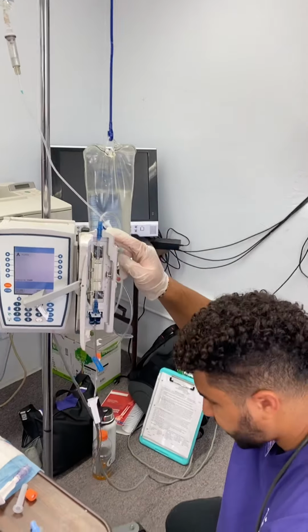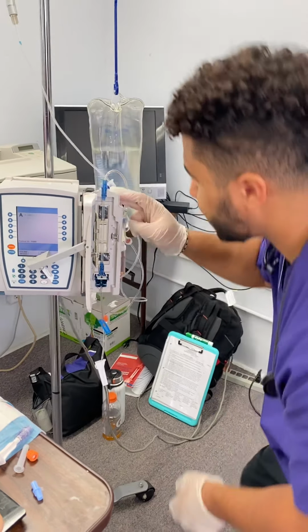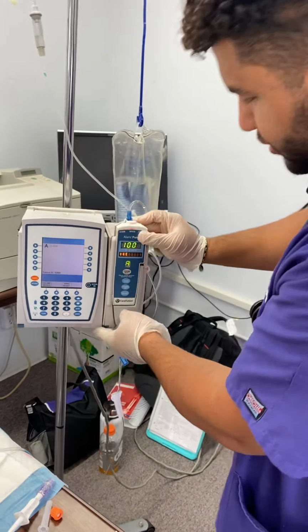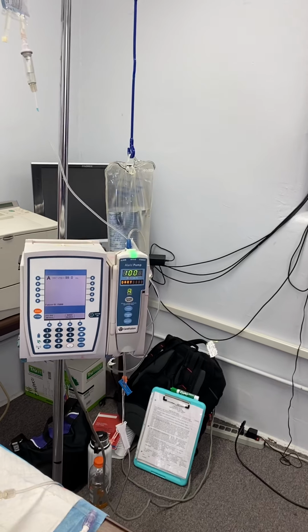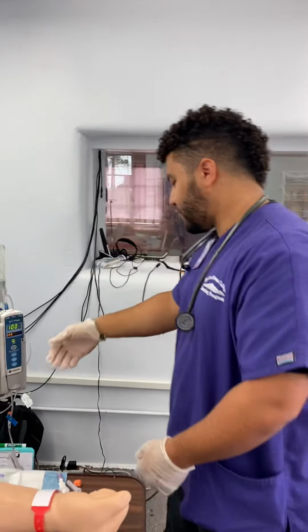Make sure there's no kinks or anything. All right, I don't see any kinks. There's no bubbles in the chamber, so we're going to go ahead, clamp that down, and then hit restart and see what happens. We did have another drop in the chamber, and there is some more air in the line.